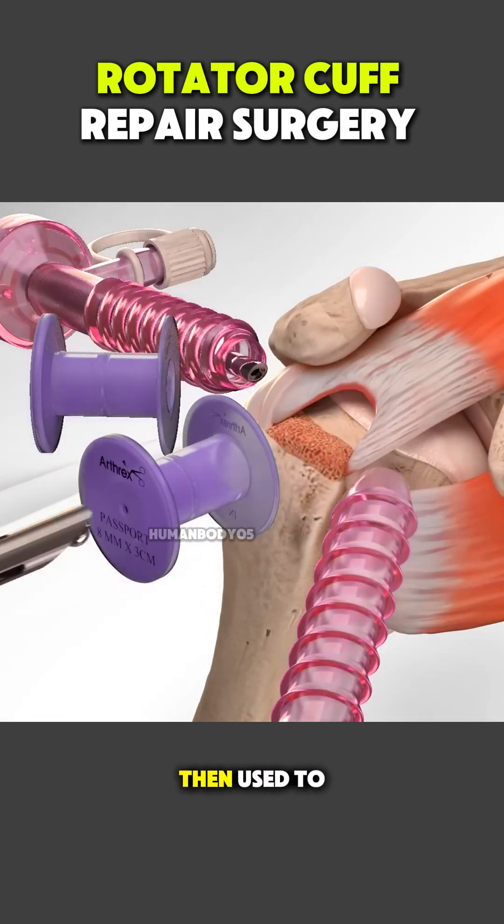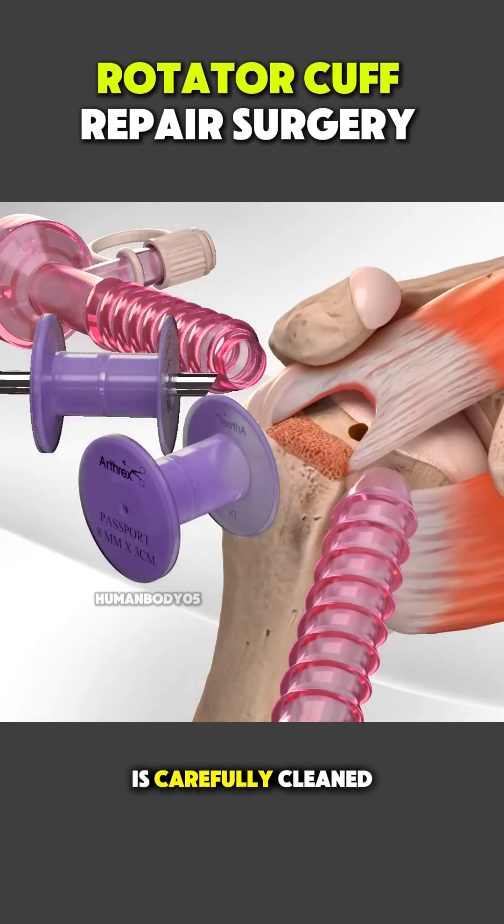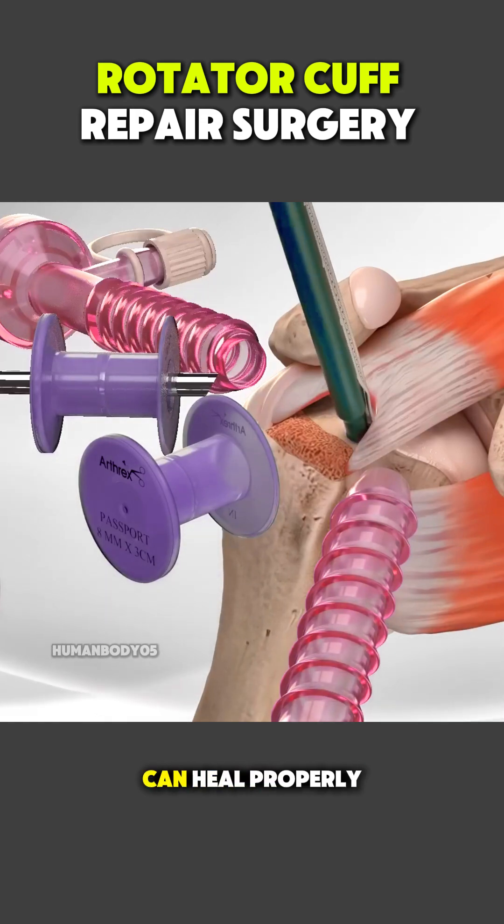Special instruments are then used to locate the torn rotator cuff tendon. The damaged tendon is carefully cleaned and the bone surface is prepared so the tendon can heal properly.